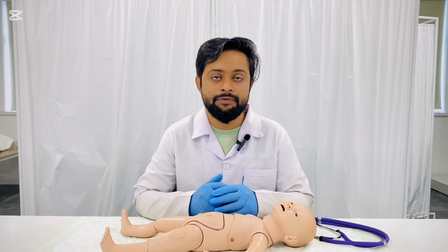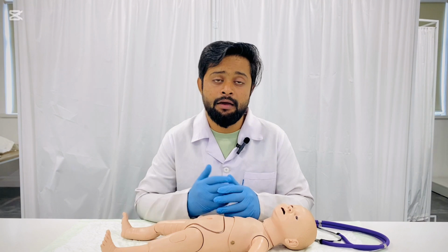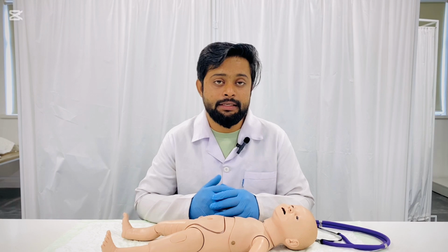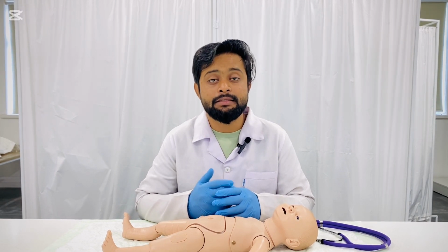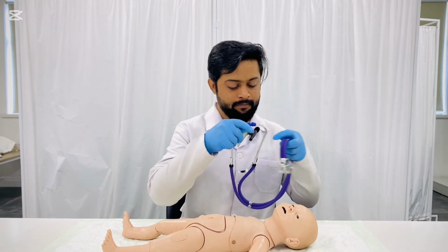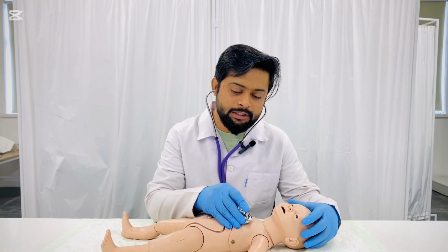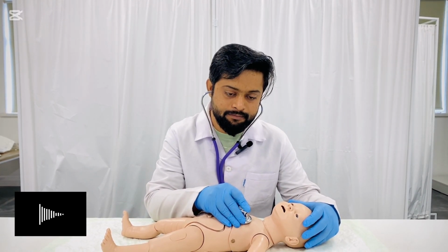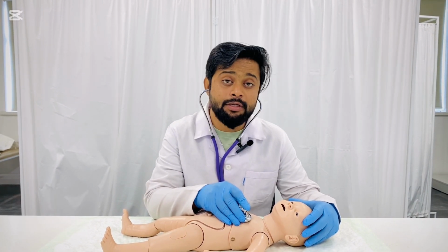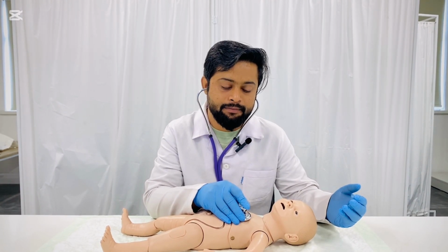As we hear, the S1 and S2 sounds are both considered to be normal sounds, but along with that, sometimes we hear other sounds also, like S3 and S4. If we talk about the S3 sound, it could be normal and is sometimes heard in smaller children. Again, we put the stethoscope and listen to this sound. It is usually heard at the apex of the heart, and it is also identified as the gallop.